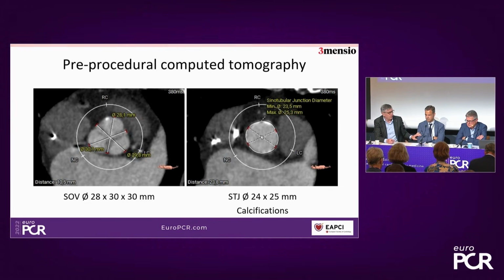Yeah. Martin, in a second, is going to talk about how to clock these devices, to have commissural alignment, to even have easier access to the coronary arteries afterwards.